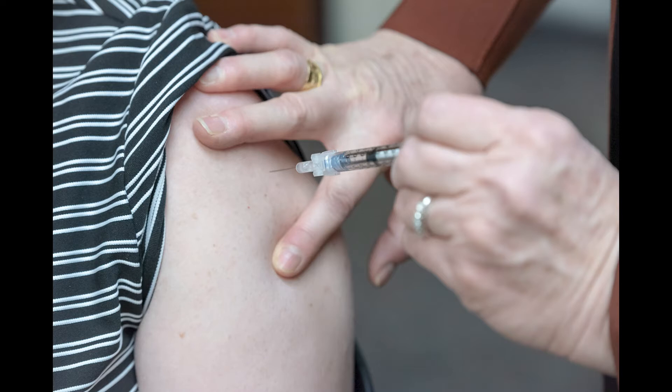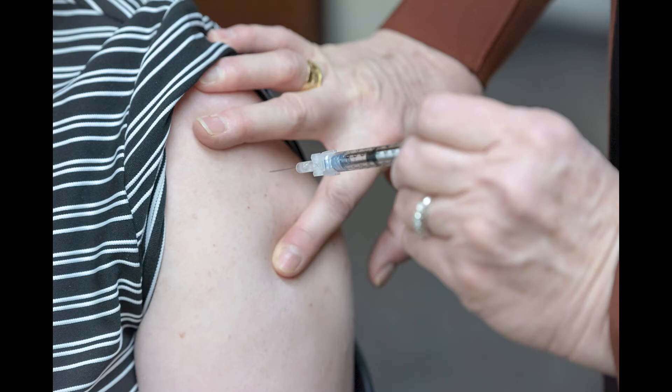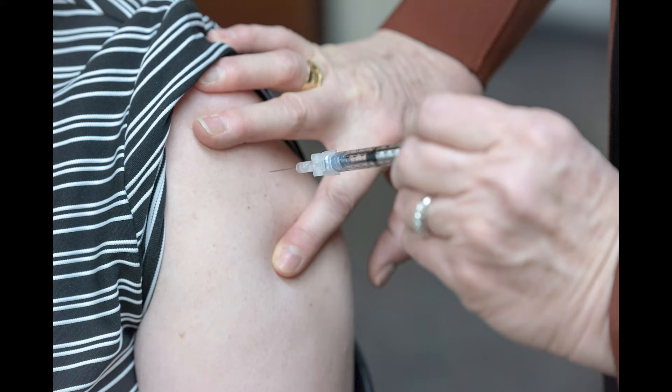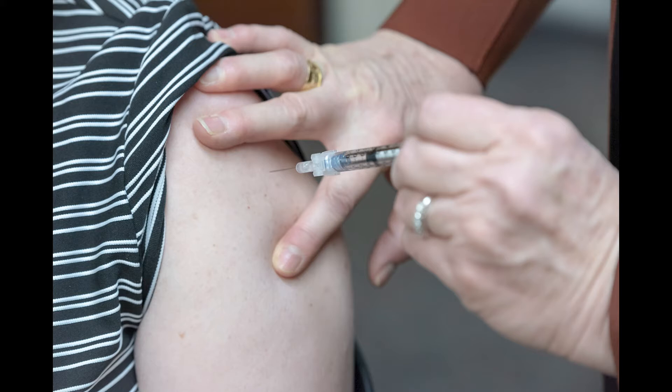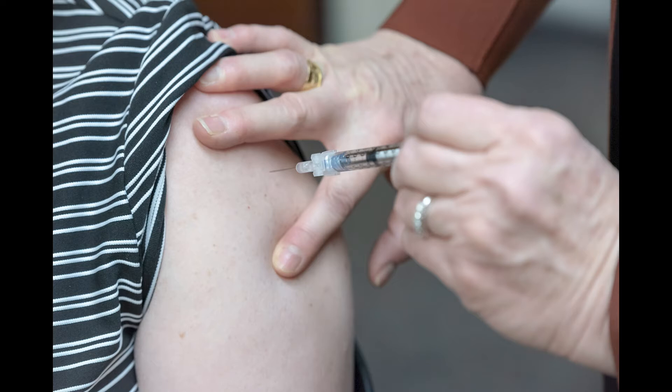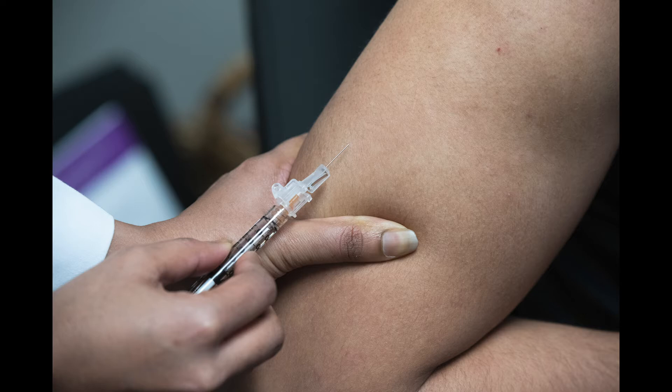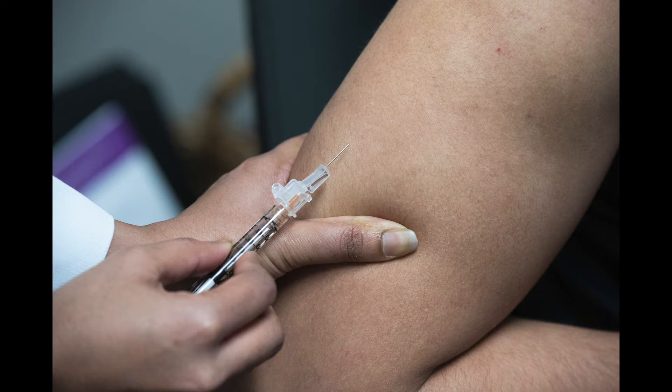For example, make sure you administer the intramuscular vaccine into the deltoid muscle and not too high and close to the shoulder joint. Insert the needle at a 90 degree angle to the skin using a needle of sufficient length, able to make it to the muscle. For subcutaneous administration, the needle is inserted at a 45 degree angle to the skin so the vaccine is injected into the subcutaneous tissue and not the muscle.